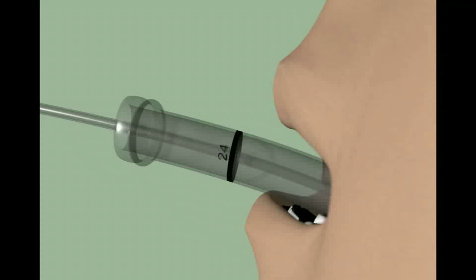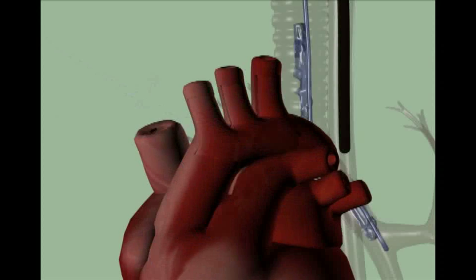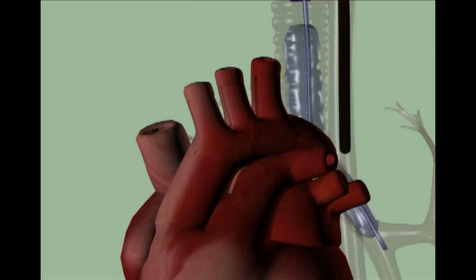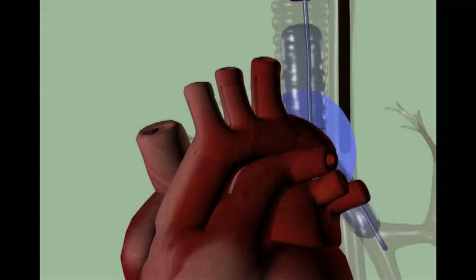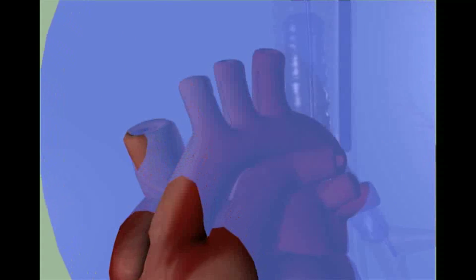The balloon is filled with a sterile saline solution that transmits the sound waves used in echocardiography. The echocardiogram combined with A-view will show the relevant part of the aorta completely, including the blind spot behind the trachea that may carry the dangerous calcifications.